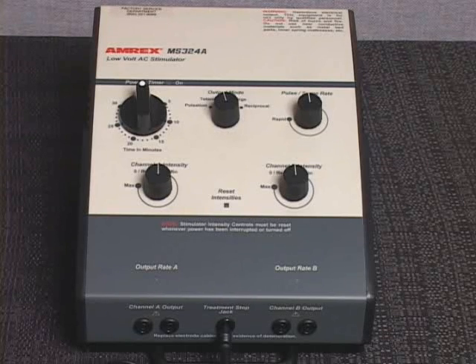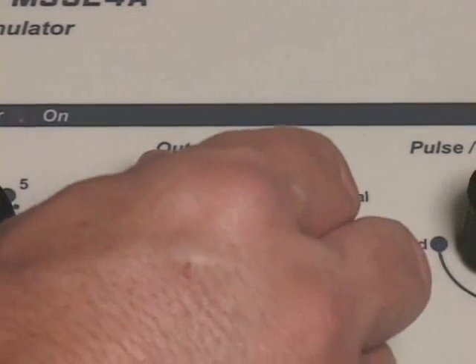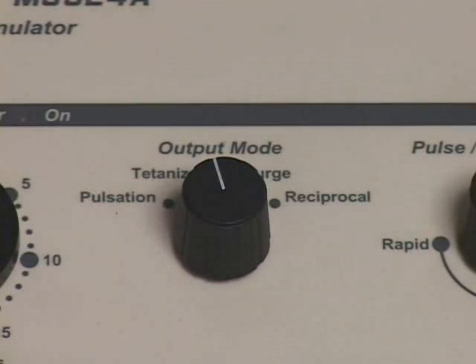The MS-324A is equipped with an intensity reset circuit feature. This feature prevents the practitioner from applying one patient's intensity setting to another patient. Set the output mode control to tetanize. MS-324A intensity levels should always be set while the device is in the tetanize mode. This will prevent unexpected surges of intensity during the initial patient setup in surge, pulsed, or reciprocal modes.